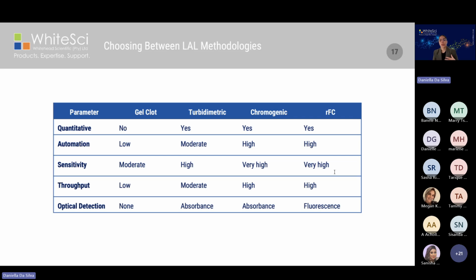So rather than just asking which method is superior, I would encourage you to ask which method best fits our product, our workflow, and our testing strategy currently. Ultimately, the best assay is the one that consistently delivers reliable, reproducible, and scientifically defensible results within your specific testing environment.